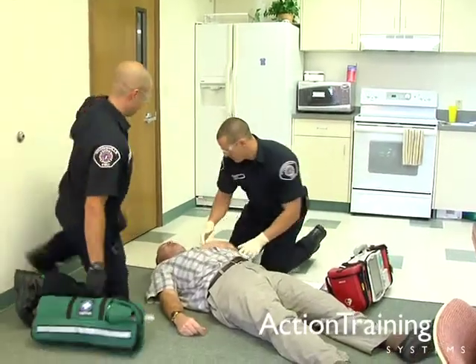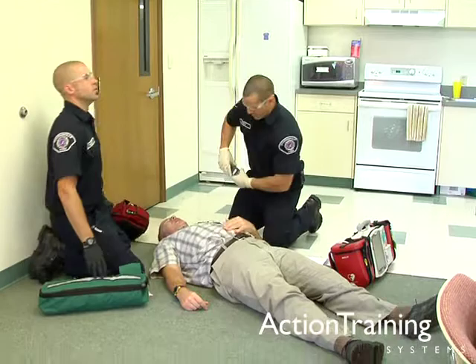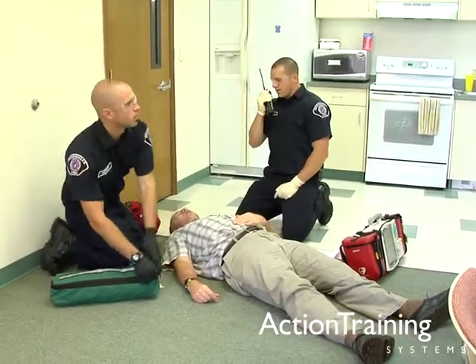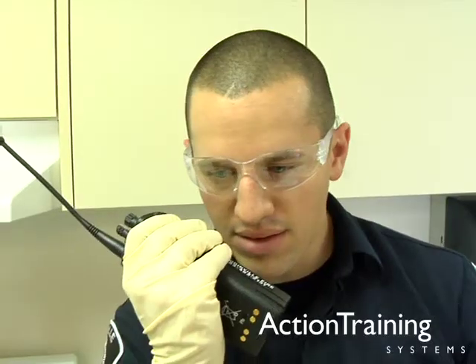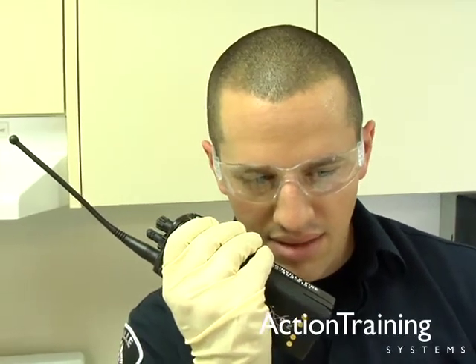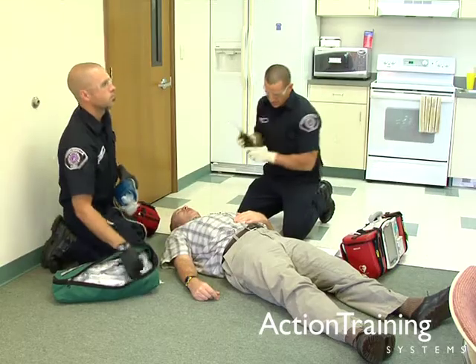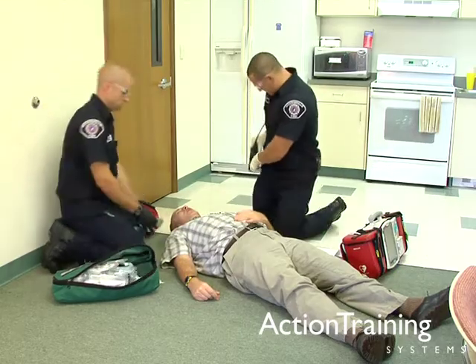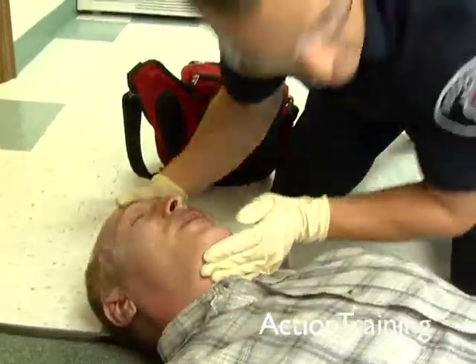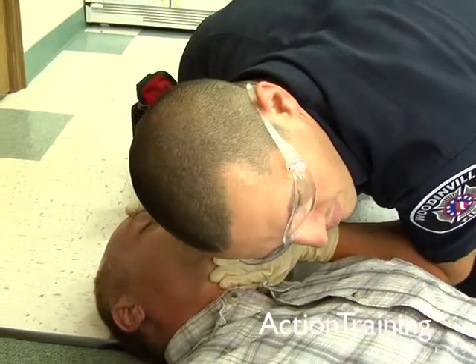In this program you have seen several techniques that can be used for the emergency management of a variety of airway issues. You have seen the signs of a compromised airway and the common causes of airway obstruction. You have seen how to assess an airway.